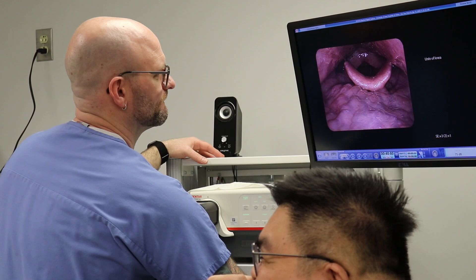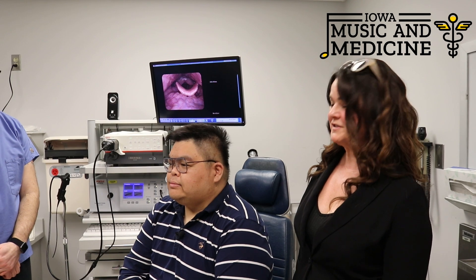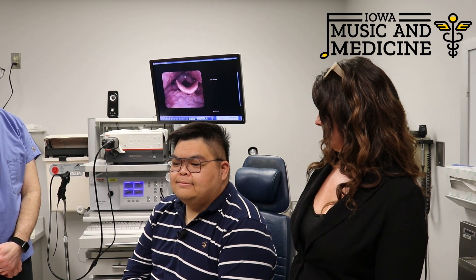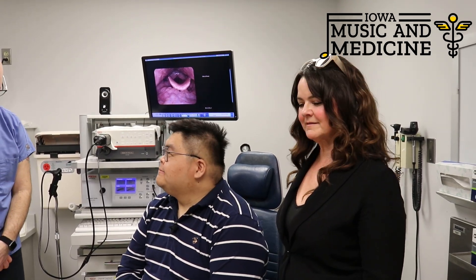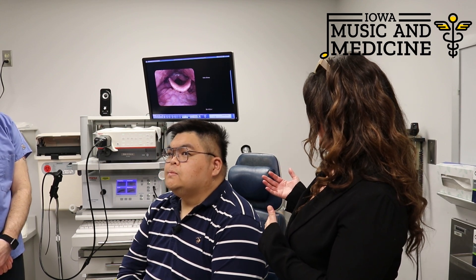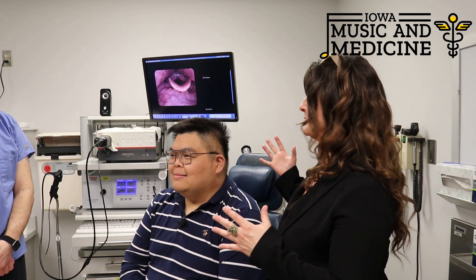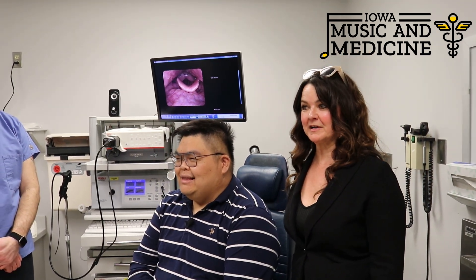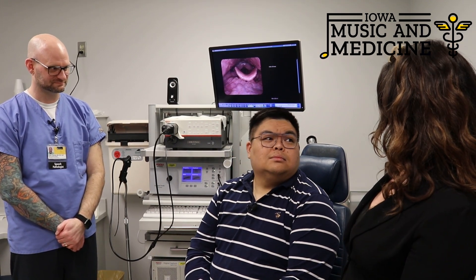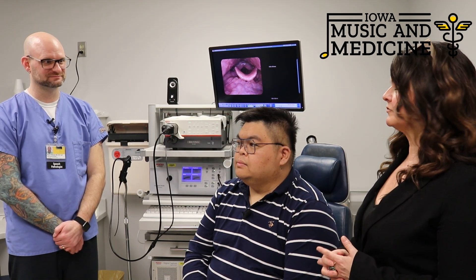That is so interesting. I'm Elise Deschamps, and I am Fu Chen Gui's teacher for his fourth year. This is fascinating. Thank you, Ryan. The nasal spray was new to me — I think that's great. Most of the time you put lidocaine in and that way you don't feel it at all in the nose. Sometimes that interferes with what's going on down in the throat — that's one reason not to use lidocaine.